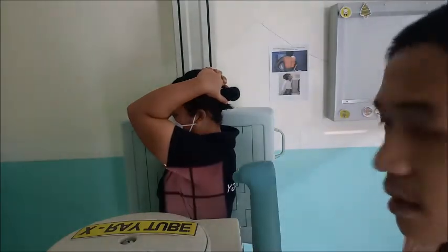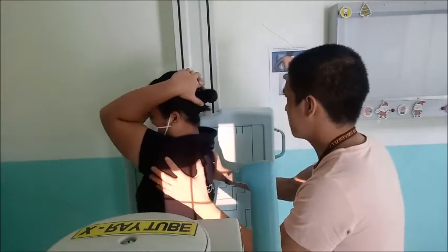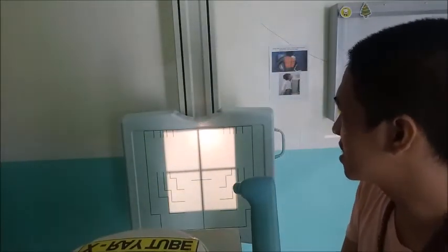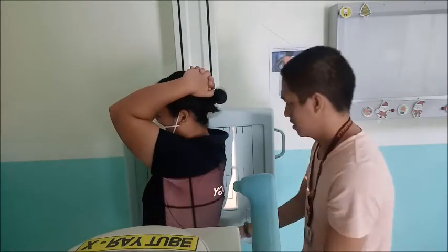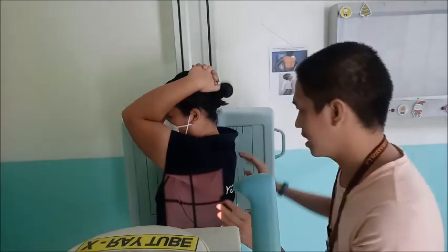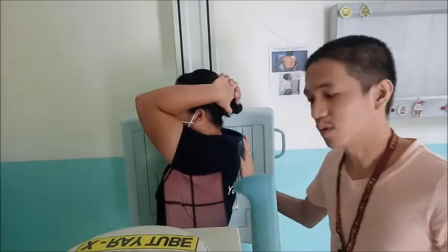Okay? So, katong collimation kanina, wala na ito i-adjust na. So, the collimation is only 11 by 14. That is the size of the cassette. Tapos, this is our patient. So medyo kuan sa collimation, no? Okay, this is only the light field. Kani siya is the entrance lang. Dili na ito makita kung asa gid siya padulong dito sa cassette.